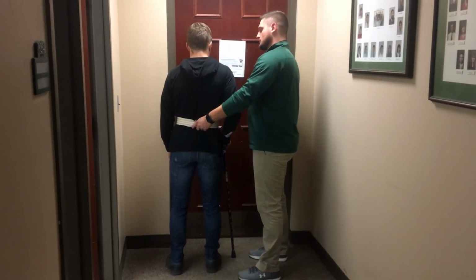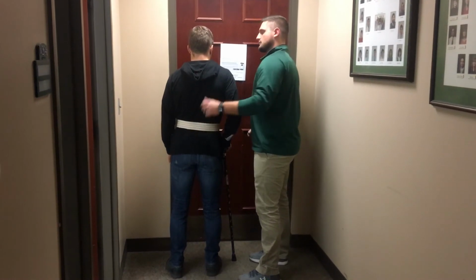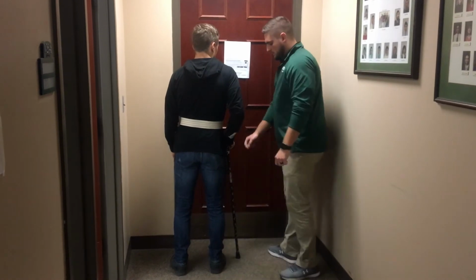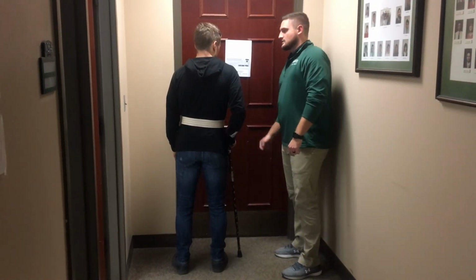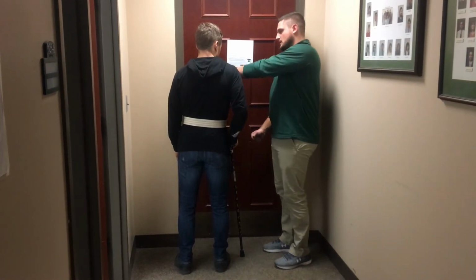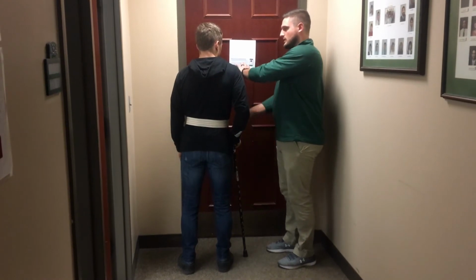Spencer, I'm going to have you approach the door. When you approach the door, shift your weight into your cane hand. When you do that, use your free hand to open the door far enough to traverse the doorway. Use the base of your cane as a doorstop against the door. Walk into your cane, and then push again, adjusting the doorstop further along the door. The third time, you can just push the door and walk on through.